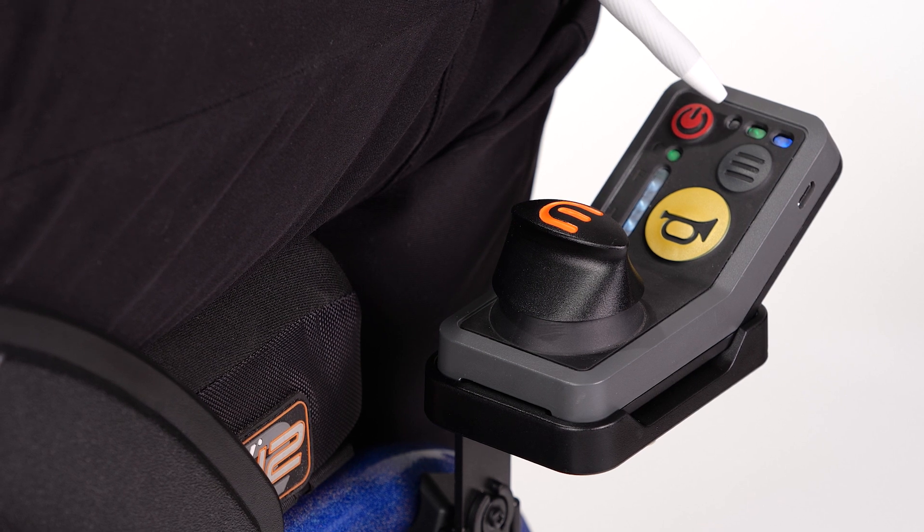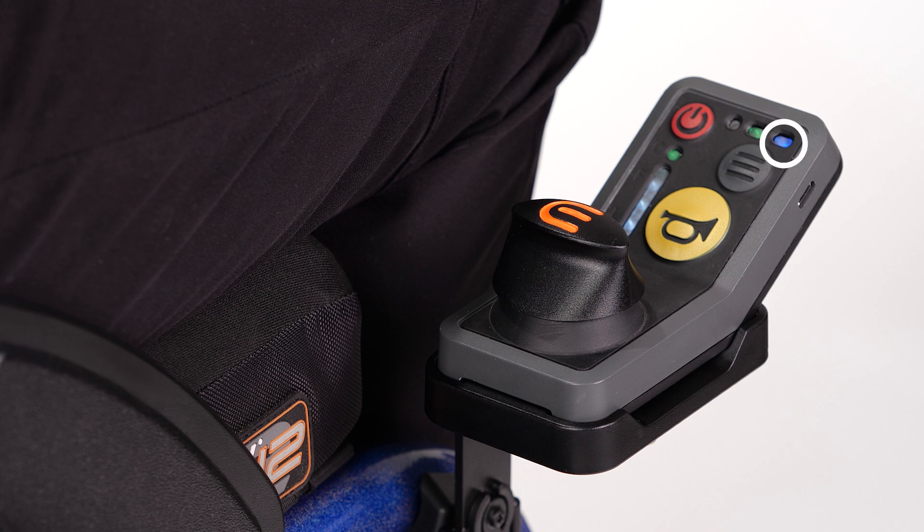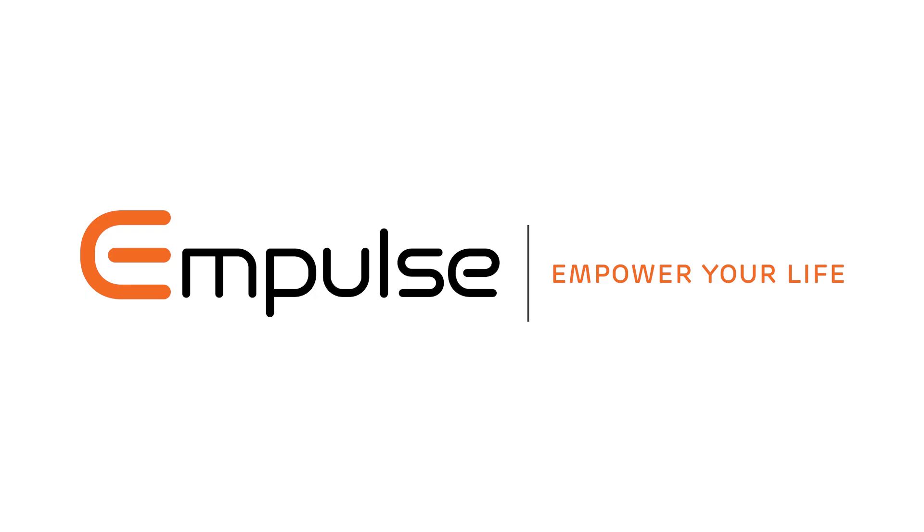The status LED on the controller will turn from white to green, and the profile LED will display either blue for speed controller or white for all-way toggle, depending on the drive mode you are in. You are now ready to begin operation. If the profile LED is blue, please refer to the speed controller operation video. If white, refer to the all-way toggle operation video. Thank you.